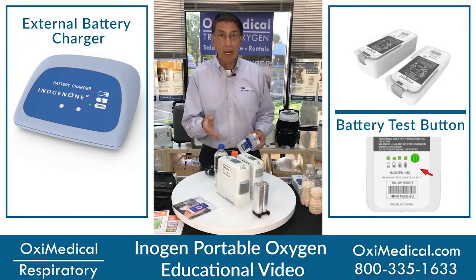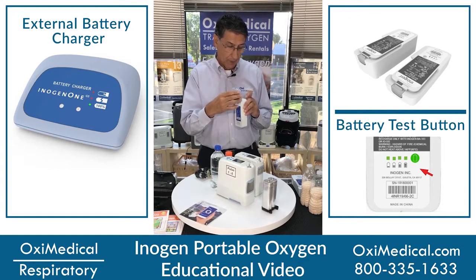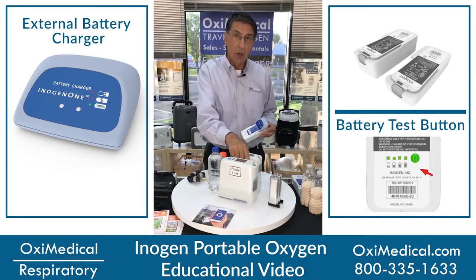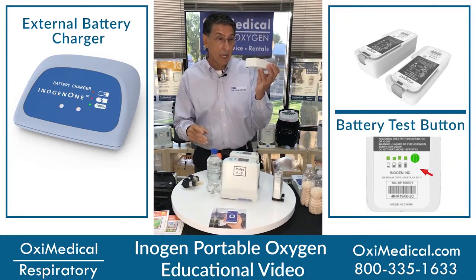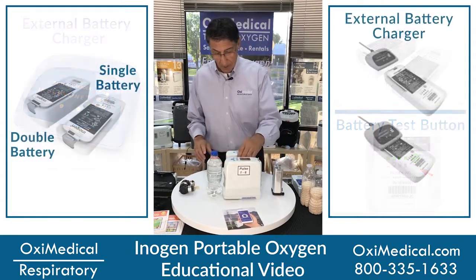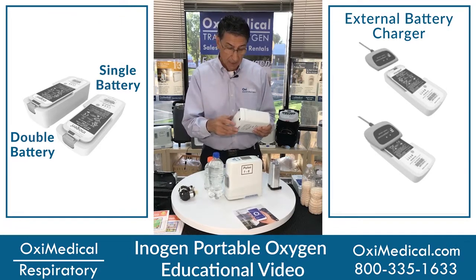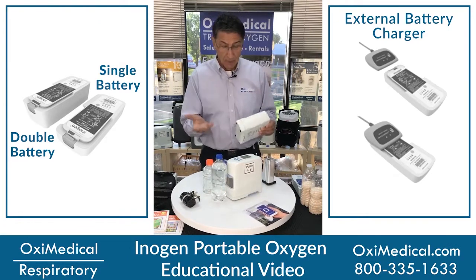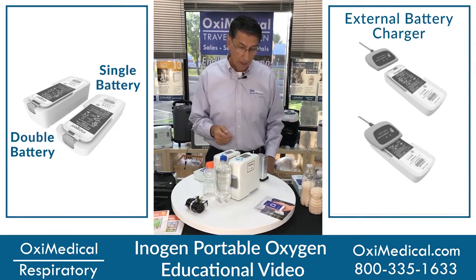The Inogen product also comes with an external battery charger. Just snap her on. You can charge one battery in the machine and another battery in an external battery charger. Or if you wish, make sure you plug the machine in at 6 o'clock in the evening, pop the other one out, pop the other one in at 9 o'clock. When you wake up in the morning, you'll have 2 full batteries.